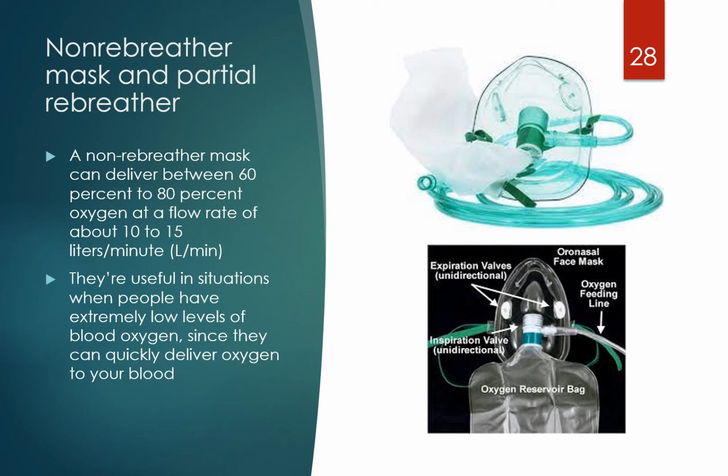So let's get into the final mask for the day, the non-rebreather or the partial rebreather. Basically, this is a mask that has a reservoir system. That reservoir system actually holds fresh oxygen in it, so when the patient inhales and exhales, they always get a fresh supply of oxygen. Typically, the liter flow rate is anywhere from 10 to 15 liters per minute, and it could deliver an FiO2 anywhere from 60 to 80% or even higher. Again, the tighter the mask, the higher the level of FiO2.